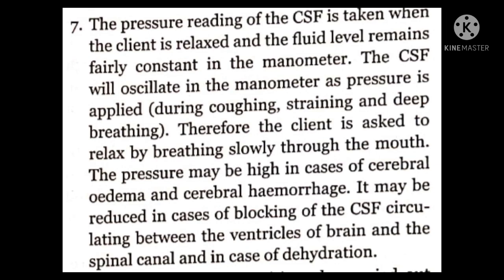7. The pressure reading of the CSF is taken when the client is relaxed and the fluid level remains fairly constant in the manometer. The CSF will oscillate in the manometer as pressure is applied during coughing, straining and deep breathing. Therefore, the client is asked to relax by breathing slowly through the mouth.